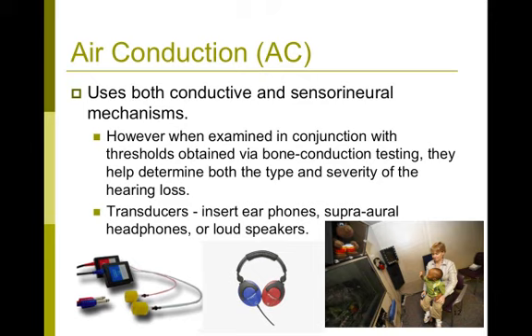However, when we're using air conduction along with bone conduction testing, now not only can we determine the severity of the hearing loss, we'd also be able to do a differential diagnosis and determine the type of the hearing loss.